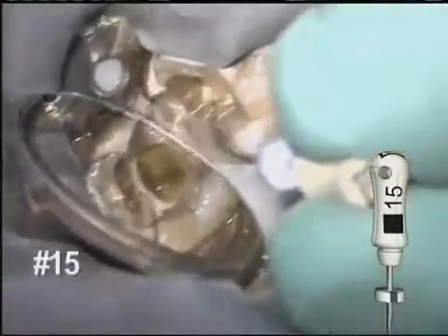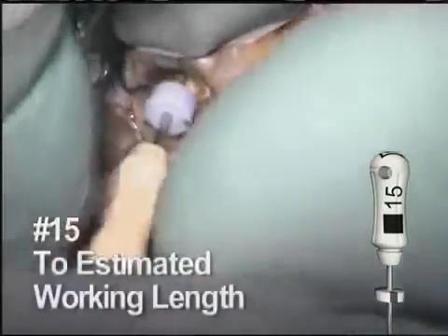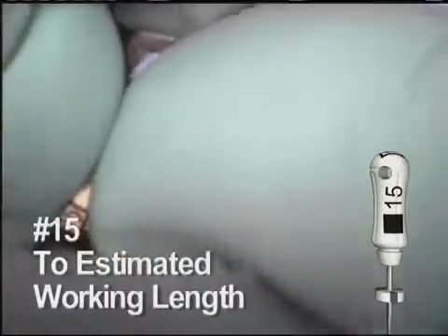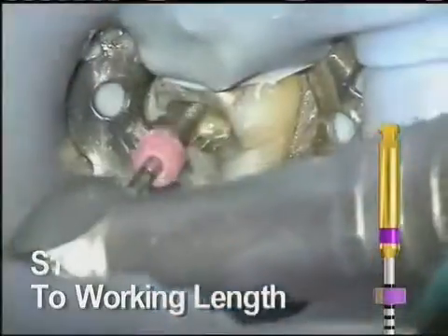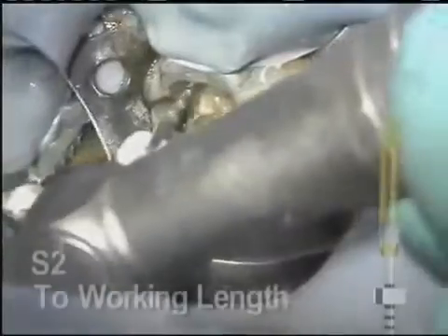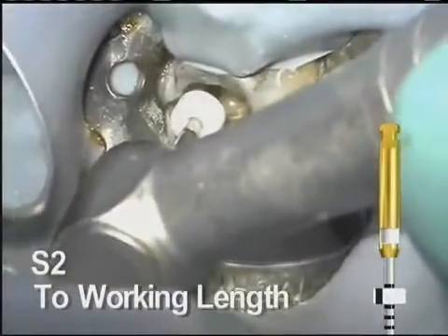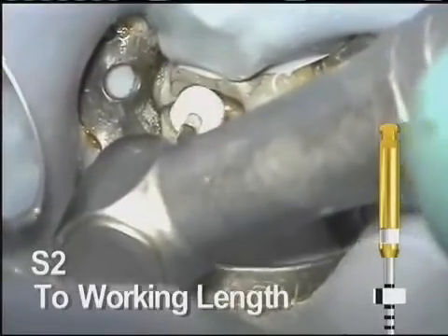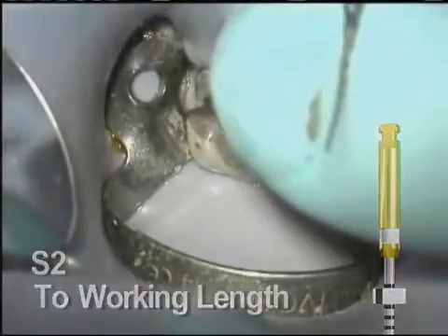The number 15 hand file is then allowed to follow. These instruments create enough of a glide path to allow the ProTaper Universal instruments to comfortably shape the apical portion of the canal. S1 is reintroduced and is easily taken to length. Once it reaches working length, remove it. The S2 easily follows to length and the canal has a nice tapered shape throughout. Always remove, clean, and inspect every rotary instrument frequently throughout the procedure.